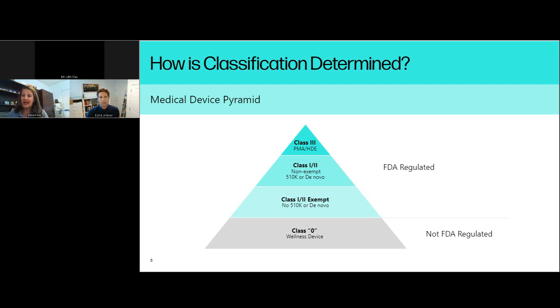When we get into additive manufactured devices, we have that same sort of thing, and we'll use FEA, or finite element analysis, to determine what represents worst case for the family, because these geometries are getting more complicated and it's not as easy to just do a cross-sectional area or an engineering analysis. So we'll do an FEA analysis, run static tests in our lab, and do a comparison to validate the FEA model. That serves two purposes. It shows that we have correctly identified worst case, and it also allows our clients to make parametric changes on their design to see if those changes improve or take away from the performance of the device itself. So this is where we use FEA.